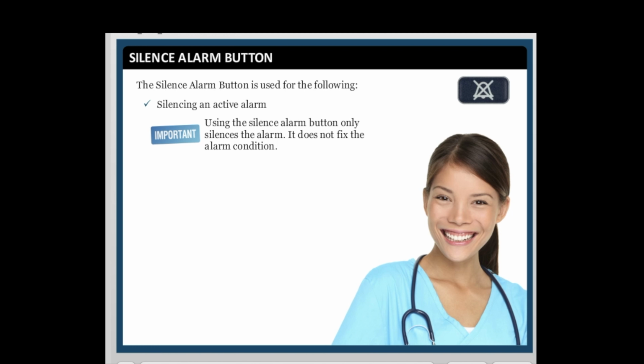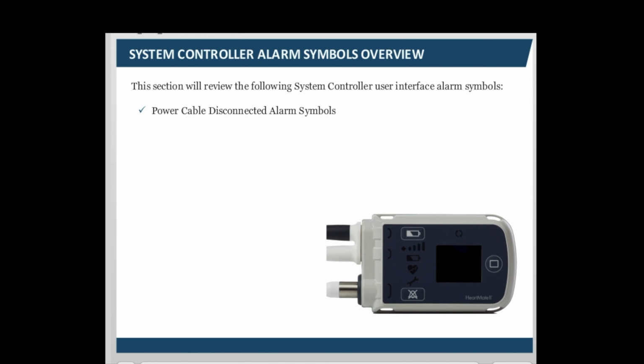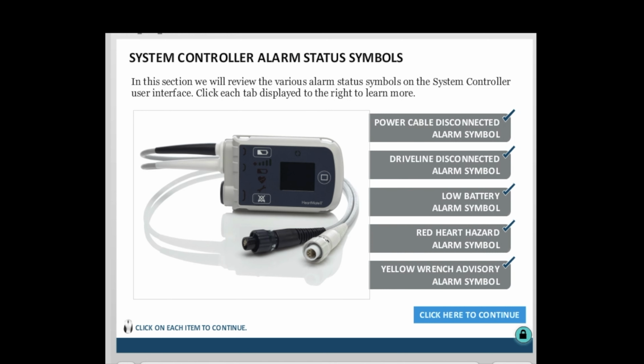The silence alarm button is also used to view the last 6 system controller alarms on the screen, as you just learned. The alarm silence period will be covered in greater detail in the system controller hazard alarm and advisory alarm modules. The system controller uses sounds, lights, symbols, and on-screen messages to communicate about how the system is working. In this section, we will review the following system controller user interface alarm symbols: the power cable disconnected alarm symbols, the driveline disconnected alarm symbol, the low battery alarm symbols, the red heart hazard alarm symbol, and the yellow wrench advisory alarm symbol.